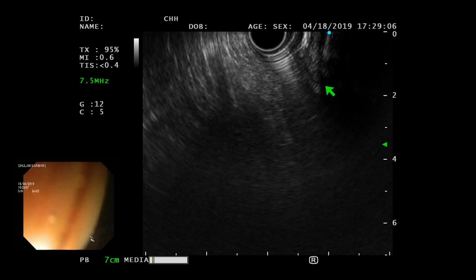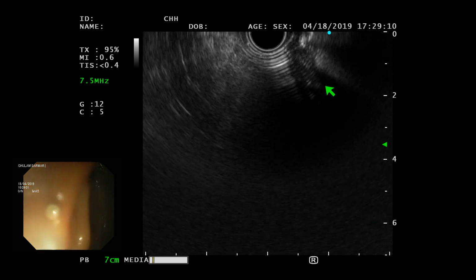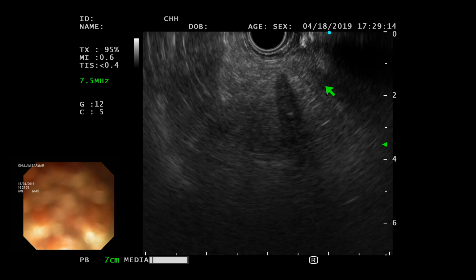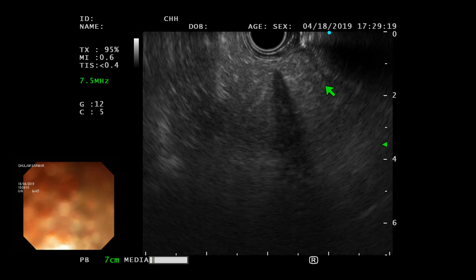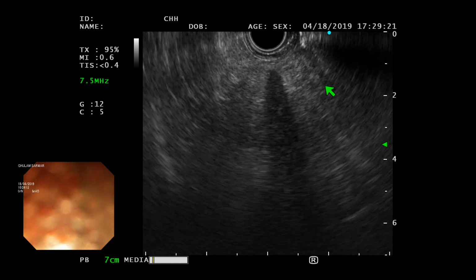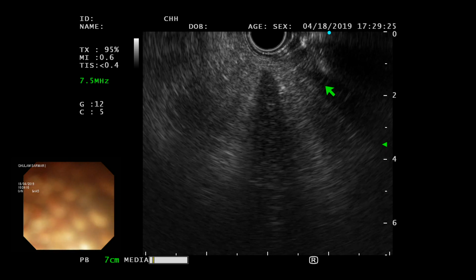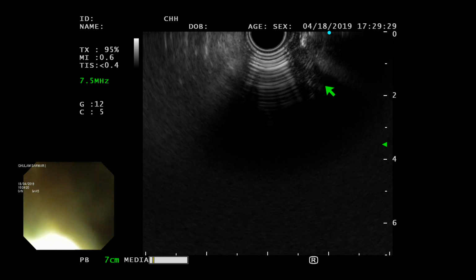But is it really a malignancy or is it all autoimmune, some sort of cholangiopathy? If these slides later come out and say it's all an inflammatory process, they don't see any malignant cells, I would suggest either we do an ERCP or we take the gallbladder out and then see what that shows.